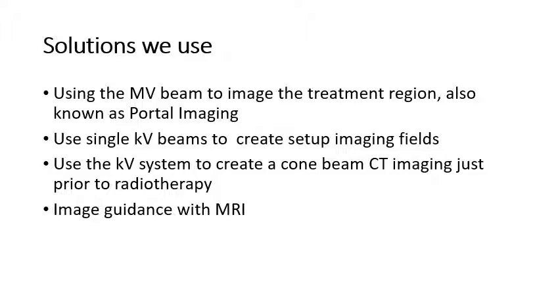In radiotherapy practice, several solutions have been implemented for image guidance. These are both X-ray and MRI based. The X-ray based systems use a high energy beam, which is convenient, but does not produce high quality images. Kilovoltage beam produces better images, but requires additional systems to the linear accelerator. MRI systems offer improved ability to visualize and locate tumor tissues, but are quite complicated to integrate with linear accelerators.